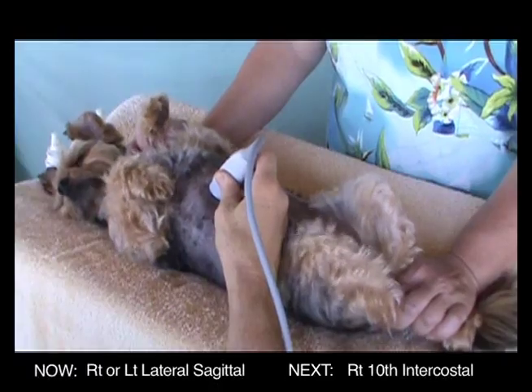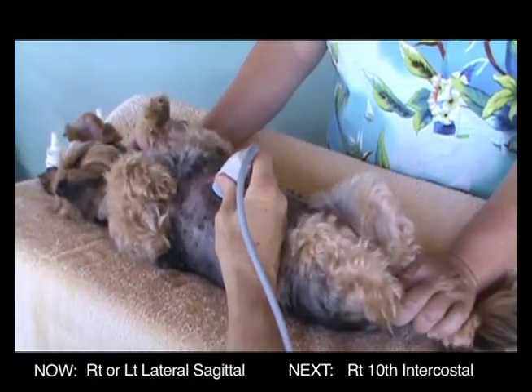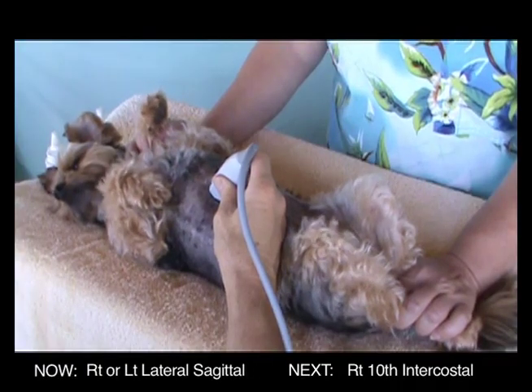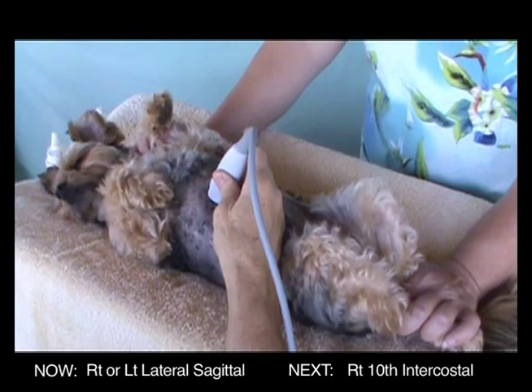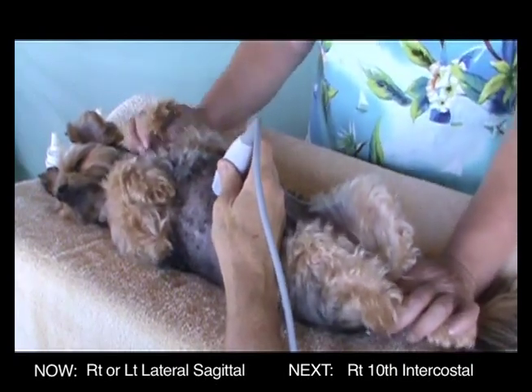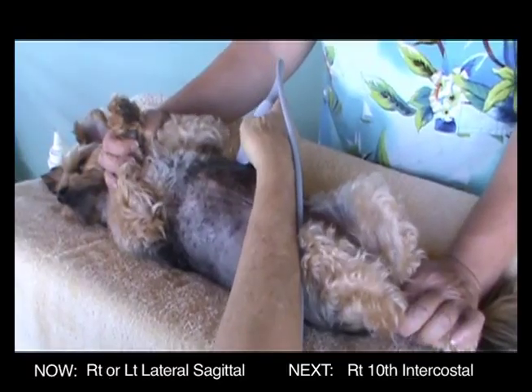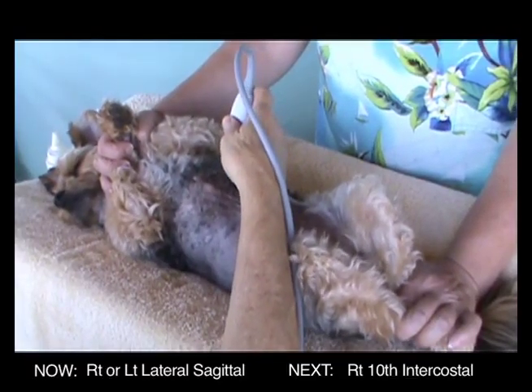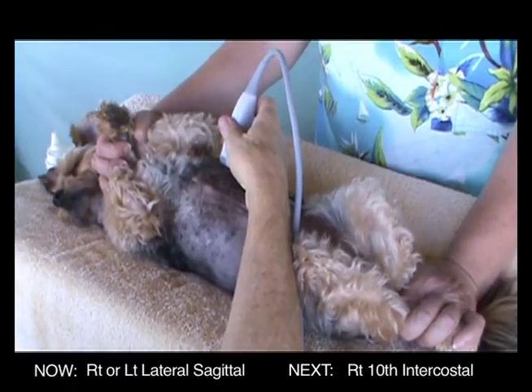In such a case, the transducer can be placed over the patient's rib spaces on the right or left side and in a sagittal or transverse position. You can place the transducer wherever it needs to be to see the gallbladder. Rib shadows may partially obstruct the view in an intercostal approach.